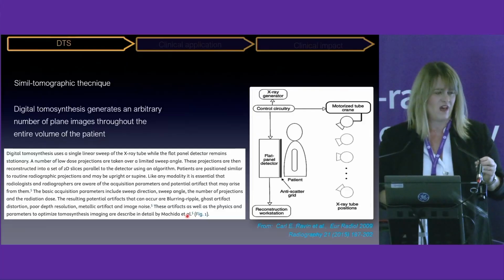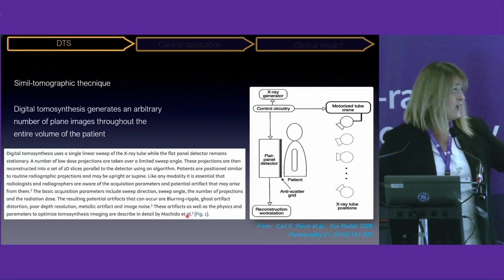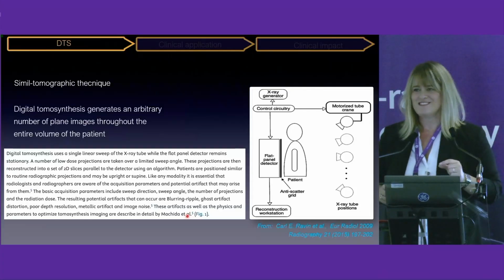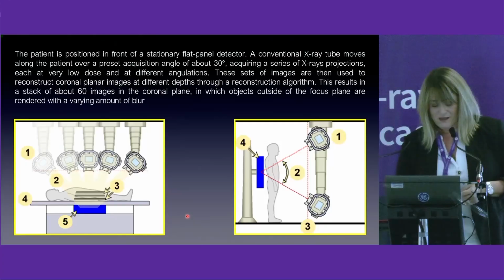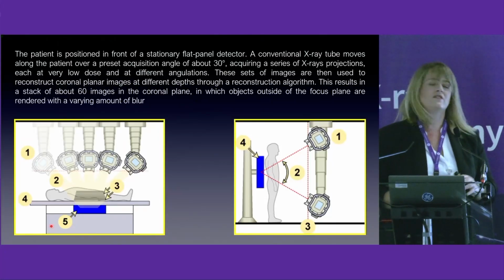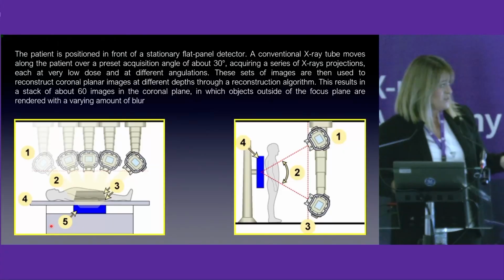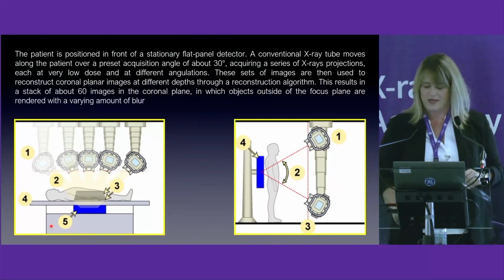If you have a very old patient with respiratory distress symptoms, DTS is not a good option, so we have to select patients to obtain the best results from DTS. Very interestingly, we can perform it in the upright and supine position, so if the patient can't stand upright, we can perform DTS supine.